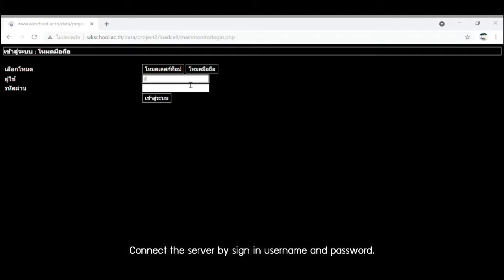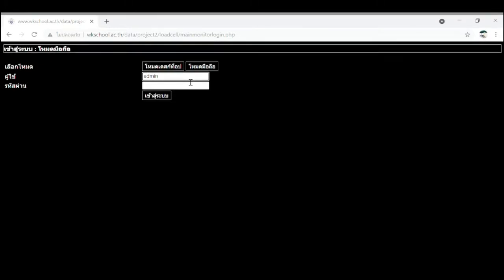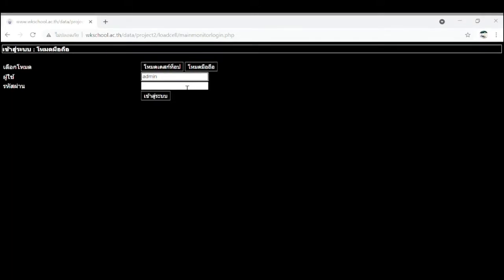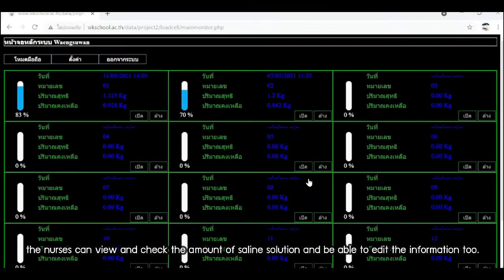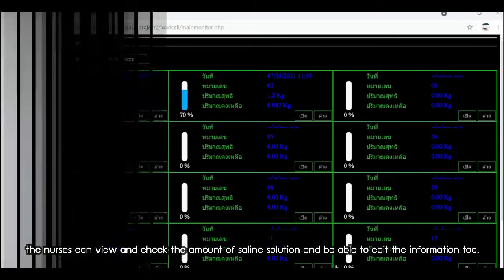Third, connect to the server by entering the username and password to log into the system. The nurse can then use and check the amount of saline solution and edit the information through the interface.